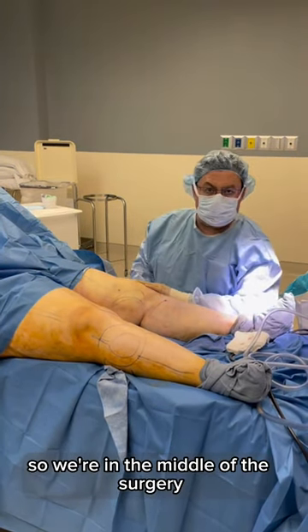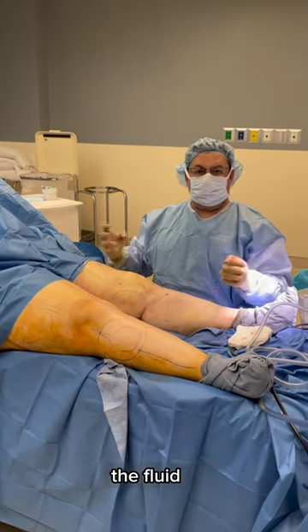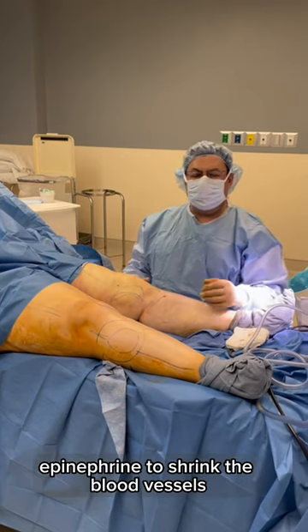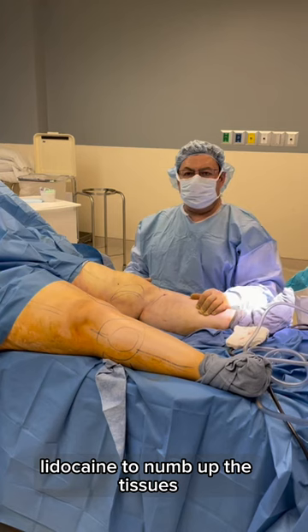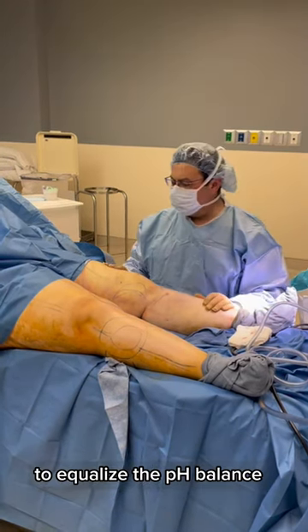So we're in the middle of the surgery. I infiltrated this leg with tumescent solution — the fluid that we put in. That fluid usually contains saline, epinephrine to shrink the blood vessels, and lidocaine to numb up the tissues. We'll sometimes use bicarbonate solution to equalize the pH balance.